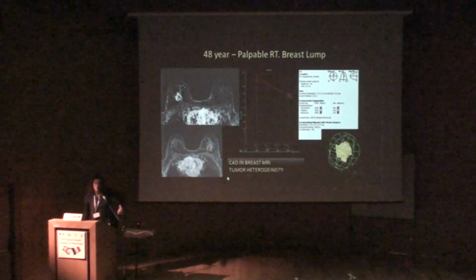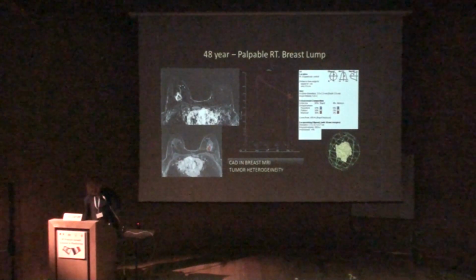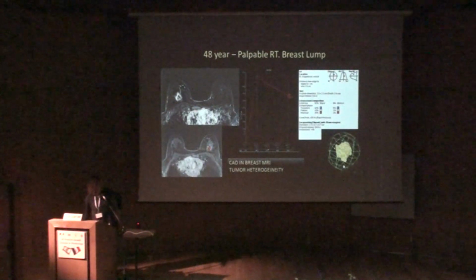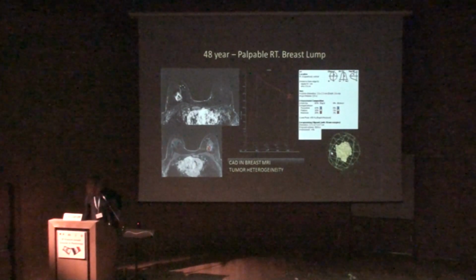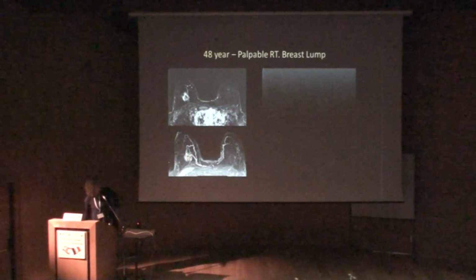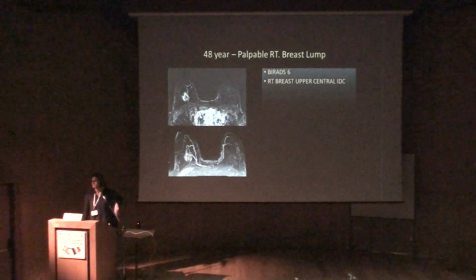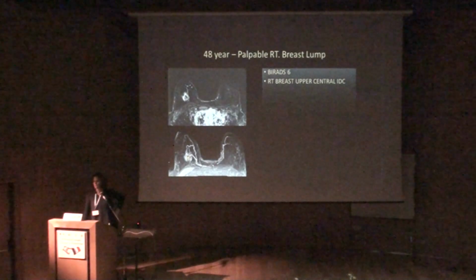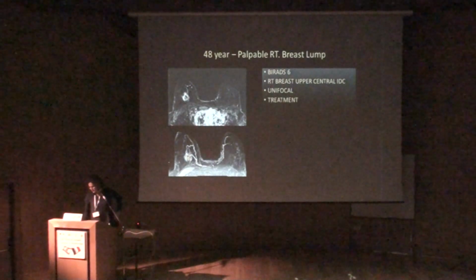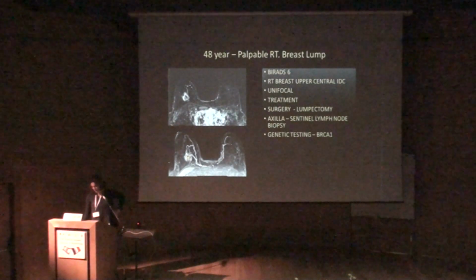We are using today in every breast MRI the CAD, the computer-assisted detection software. There are different vendors, and it gives us those maps, okay? We can also have the dimensions of the tumor and the shape of the tumor, okay? So this is the MRI compatible with the lesion that we saw, and she can now have treatment. Lumpectomy. And she had a lumpectomy. It was a unifocal lesion. The axilla was normal, so she had a sentinel lymph node biopsy, which was normal.